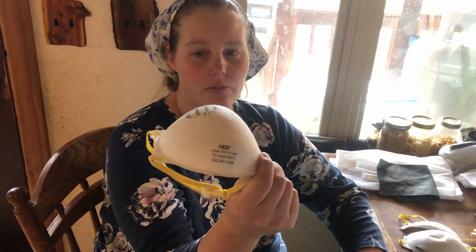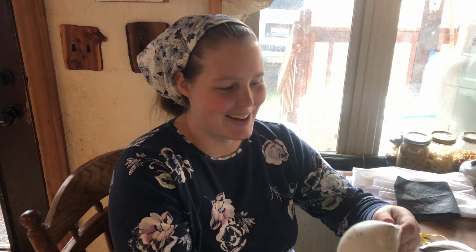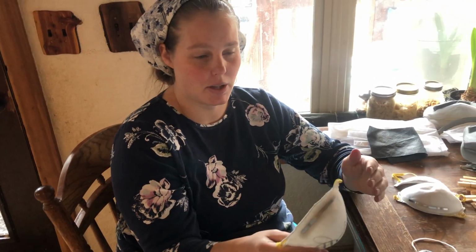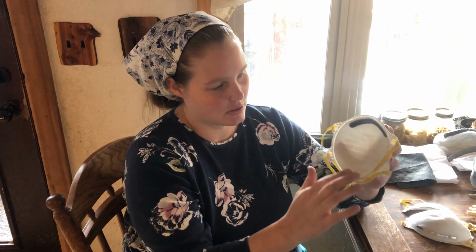This, for those of you who aren't sure what that is, this is an N95. We have them for construction work. It keeps the insulation dust from getting into your lungs. This is my son's N95, it's got a B on it. So anyway, what makes the N95 so special? Well, there's a lot of things to it, and I wanted to know exactly what it was, so I decided to dissect one and show everybody, because not everybody has access to these. And then we'll donate the rest of our box to the hospital, but this way I can try to replicate it.